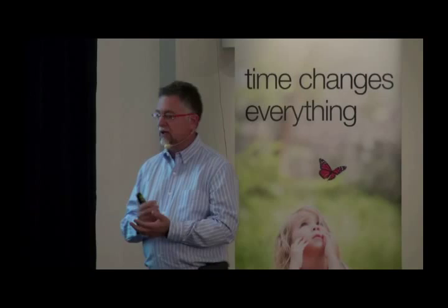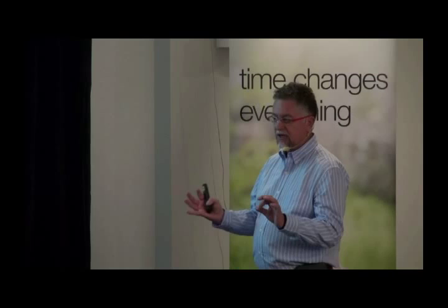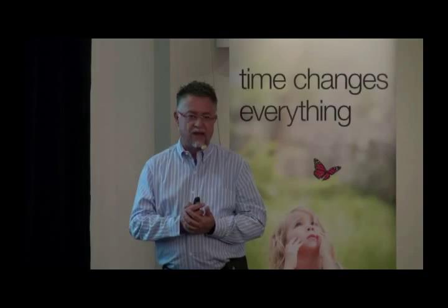So Dr. Metzger, who some of you may have met, Fred and I work together, I work in their practice. I like a statement he makes all the time. He says, impedance counters are great analyzers for clinics that see only healthy dogs, all right? So if you see only healthy dogs, it's a great analyzer, but you will not need to look at a single blood smear. But anytime you have abnormalities, you must verify it with a blood smear. I'm going to show you two cases run with the impedance counter, and then I'm going to show you a ProCyte, and I'm going to show you a blood smear for you to see how this will bite you in the gluteus maximus if you're not looking at the blood smears.